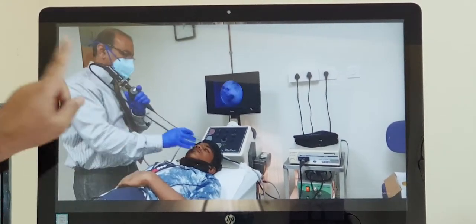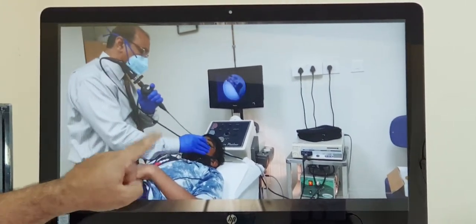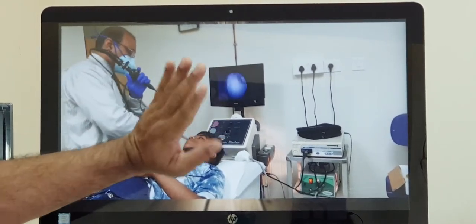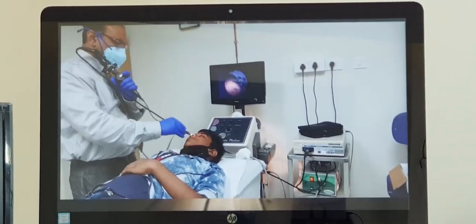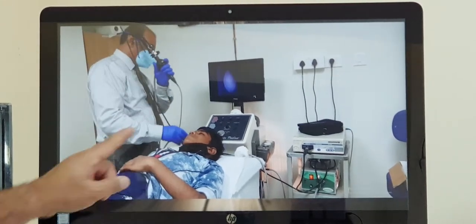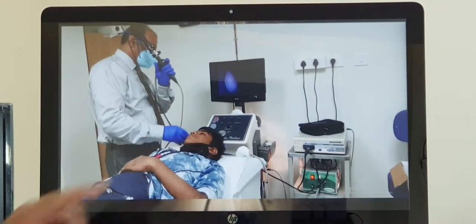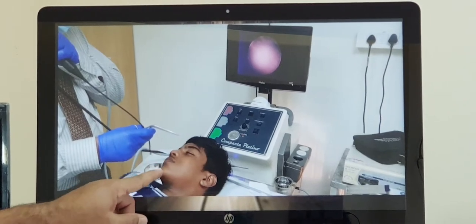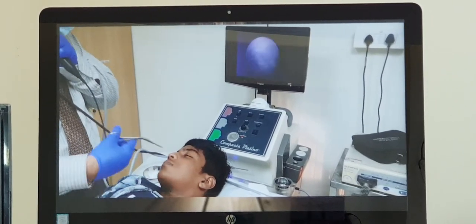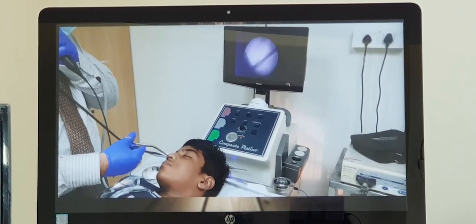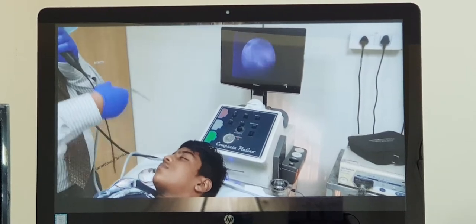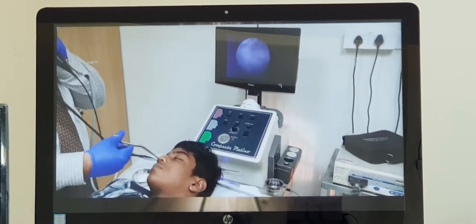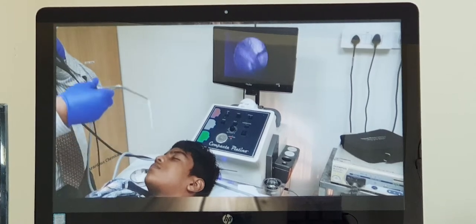This is the nasal endoscope. I have cleaned the nasal endoscope tip with an anti-fog solution so that the picture and video are very clear. I am now examining both nasal cavities with the endoscope. Before proceeding, I will remove the cotonoids — one cotonoid removed, and this is the second one, which is now removed.